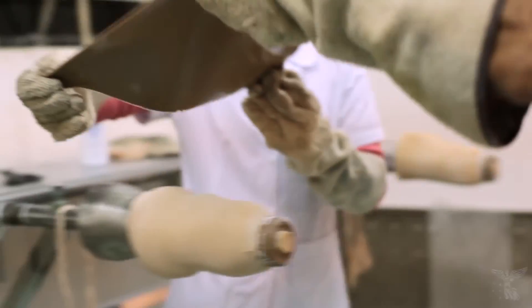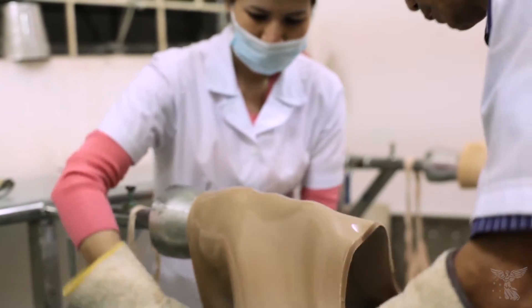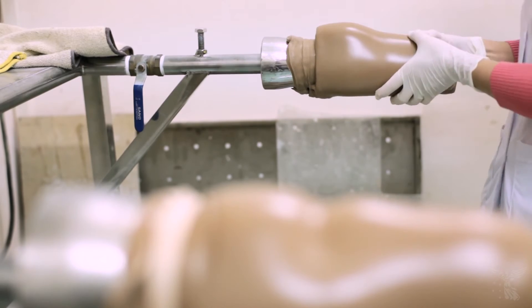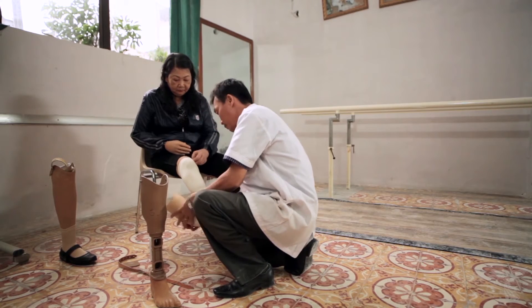And using that, we can drape polypropylene, a really rugged and durable plastic, around the mould, and this forms the socket. It takes the heating in the oven, and it's done, essentially.